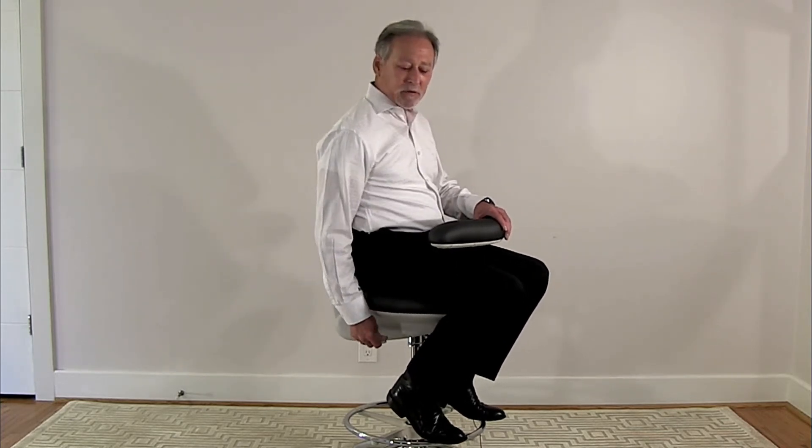On the right hand side is a seat tilt adjustment that can be set for the user to be in either a recline, an upright, or a decline position.